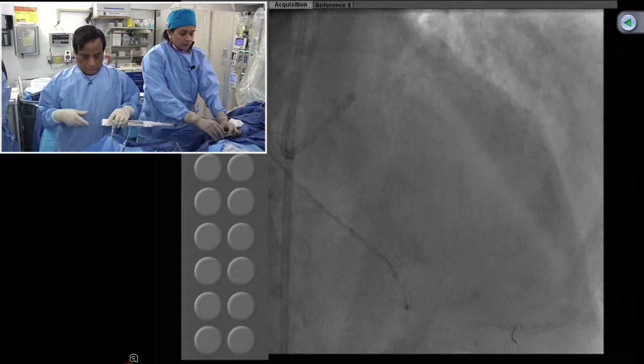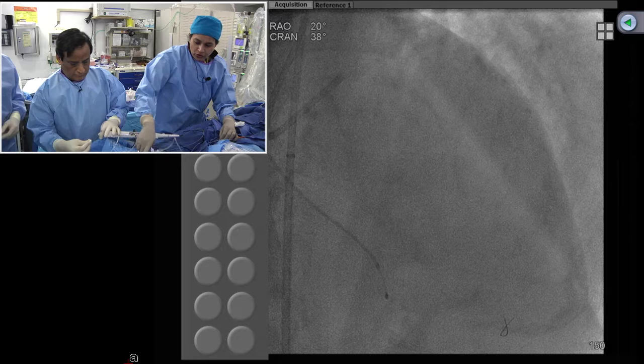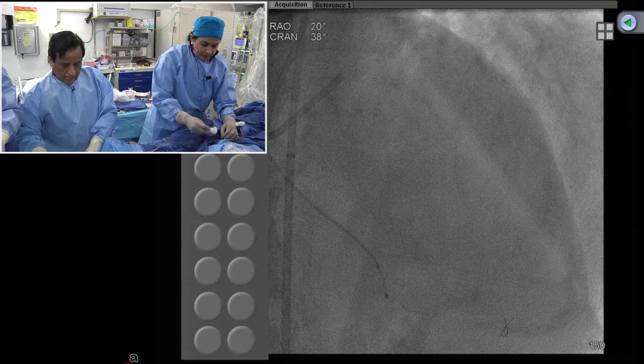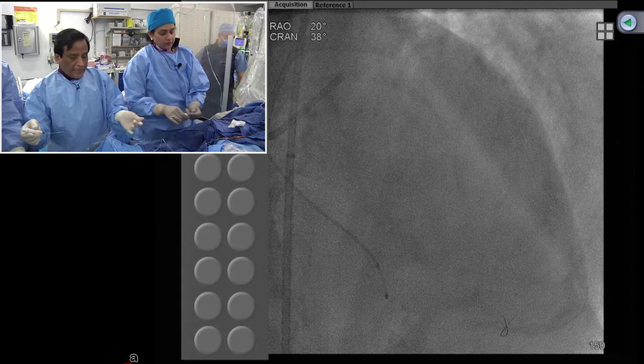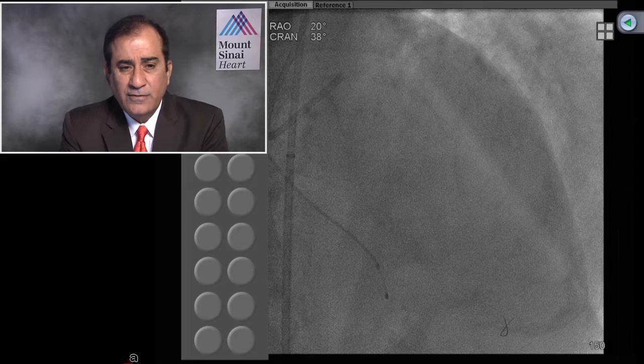This is exactly the kind of patient you definitely want to go with the rotablator. Without it, you would do multiple balloon dilations, the stent won't reach, then you'd have to use a cutting balloon and may not be able to expand the stent. Every time we went to the mid LAD the patient became very restless, confirming it was causing tremendous ischemia.